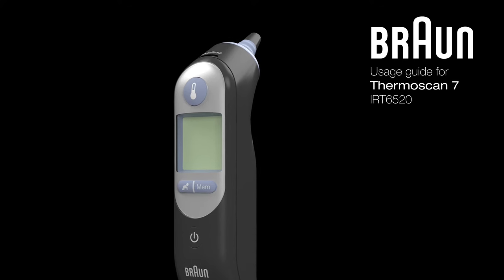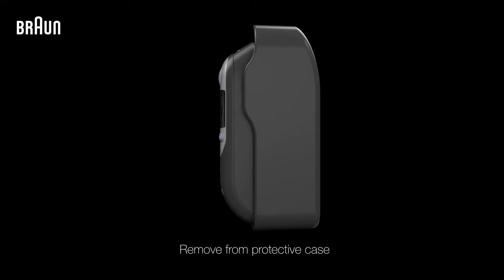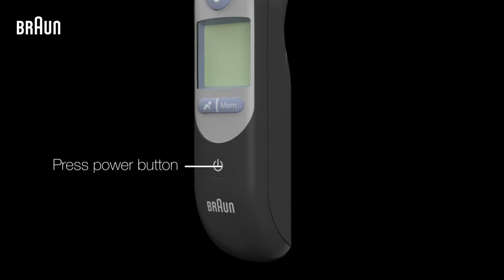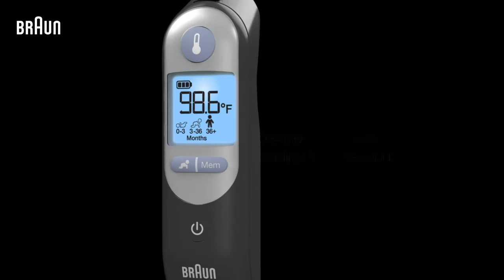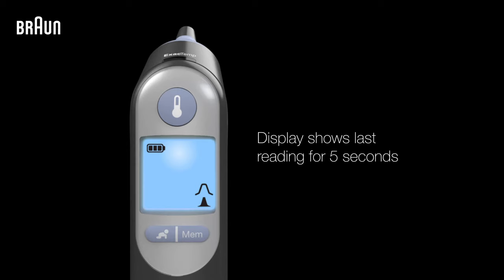Get started with your Braun ThermoScan Ear Thermometer with only a few simple steps. First, remove the thermometer from its protective case. Then press the power button to turn it on. Once powered on, your thermometer will display the last temperature it measured for 5 seconds.